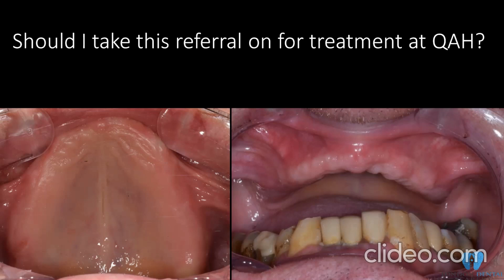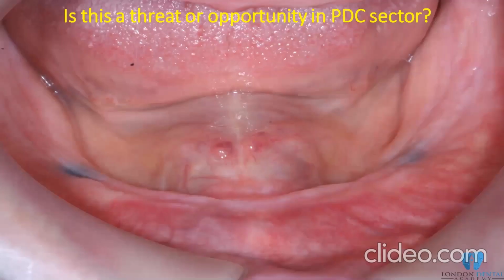This is quite normal, especially when you've got a very flat palate and very big alveolar ridges, but the denture does not stay in place. Sometimes you've got a very small ridge and very small palate, but you get very strong retention, due to the fact that you don't have a lot of function or action from the opposing teeth or arch.